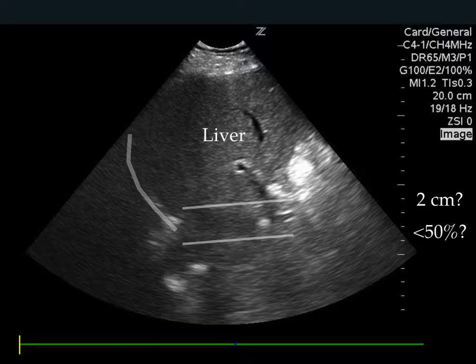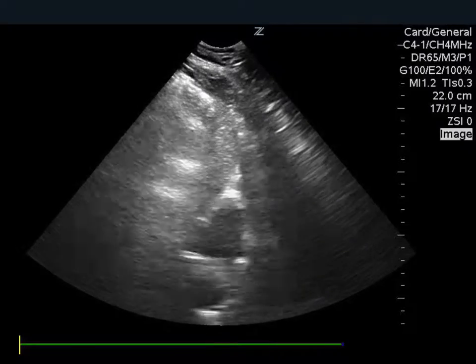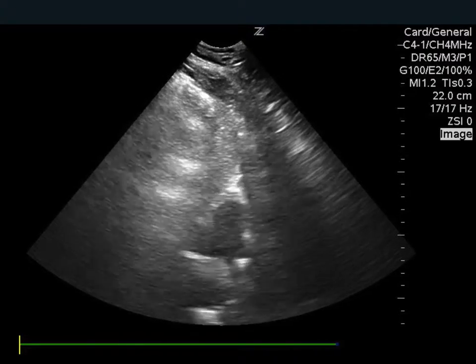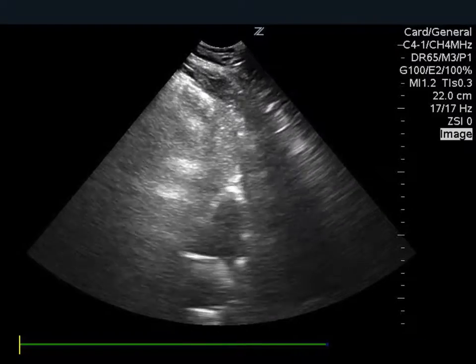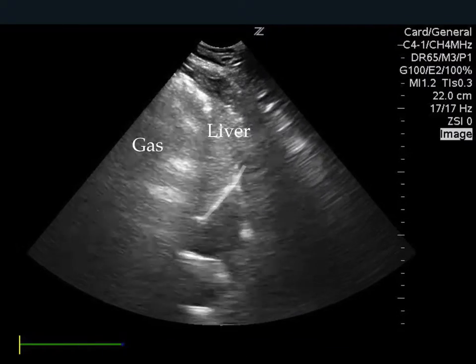But this isn't the standard view that we tend to go to when we're looking at the IVC. So let's look at the IVC from an anterior approach. This is the IVC from an anterior approach according to cardiology convention. And all that means is that the probe marker is in the right upper part of the screen and the patient's head is to screen right. We can still make out some of the main anatomy that we look for, including the diaphragm, the liver.